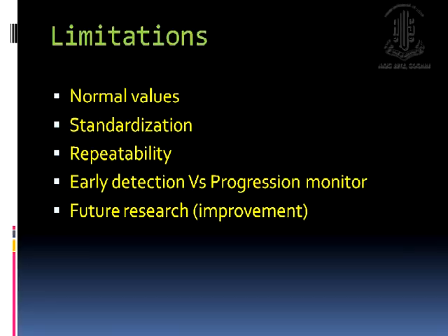Repeatability of multifocal testing also is an issue because everyone has a topographic map of the visual cortex different from the other one. That's why it's more difficult in the multifocal VEP, because everyone is different from the other. That's why you can repeat one test, and even in the same patient repeated, you move the electrode a little bit and you start getting different data.